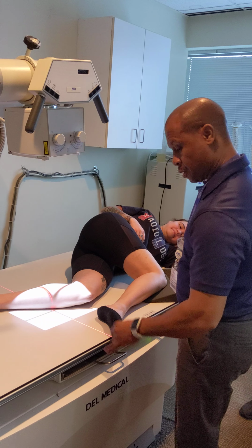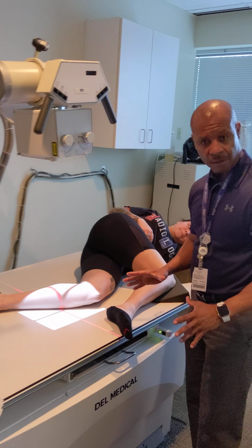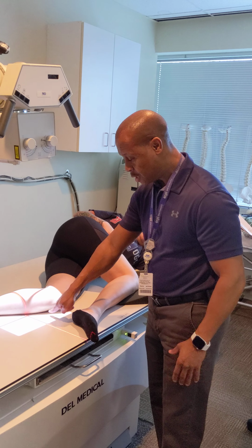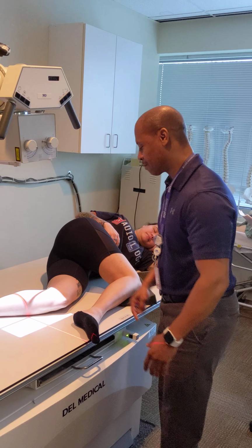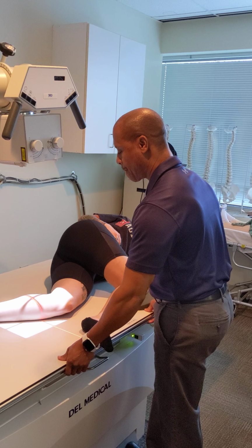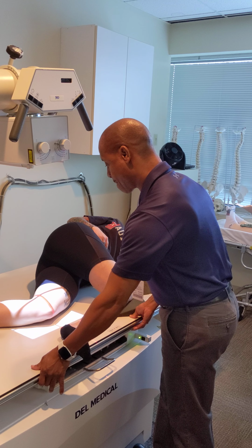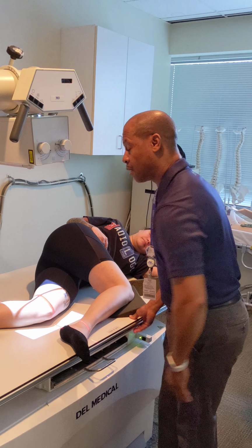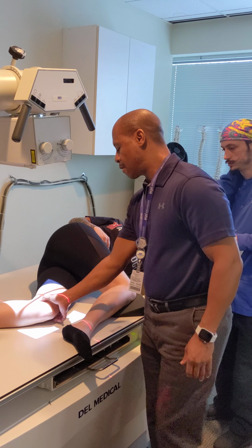All right. So now, once the patient's on their side, we are shooting medial to lateral. Once again, medial to lateral. Okay. So now, according to your paper, where's the central ray going to go? Directed to the knee and 1 inch distal to the medial epicondyle. Okay, so we're going to find that epicondyle. There it is, right there.